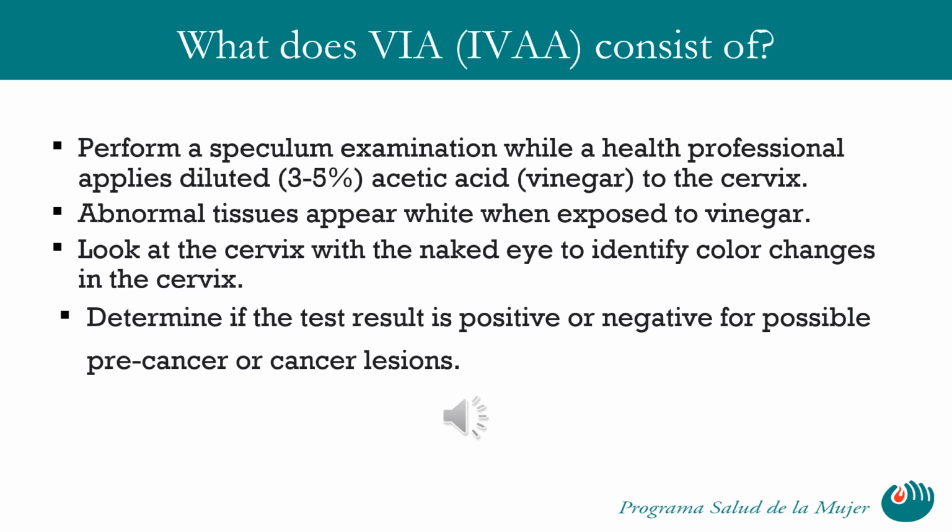Abnormal tissues will turn white when exposed to the vinegar. The cervix is then visually examined to identify any color changes. Based on the observation, the result is determined to be positive or negative for potential precancerous or cancerous lesions.